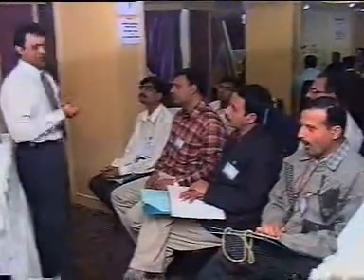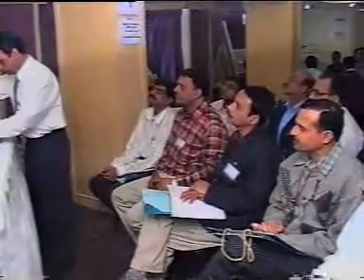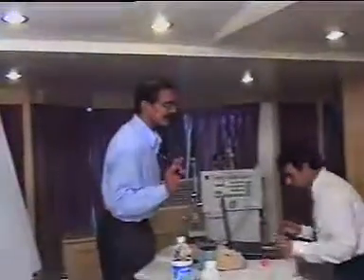Okay? Now we wanted to tell them something about it. Baby is in respiratory failure or in impending respiratory failure. We have intubated the baby. Now we want to select the PIP. What should be the PIP? We don't know the cause, RDS है, pneumonia है. Within them, maybe it has got meconium.